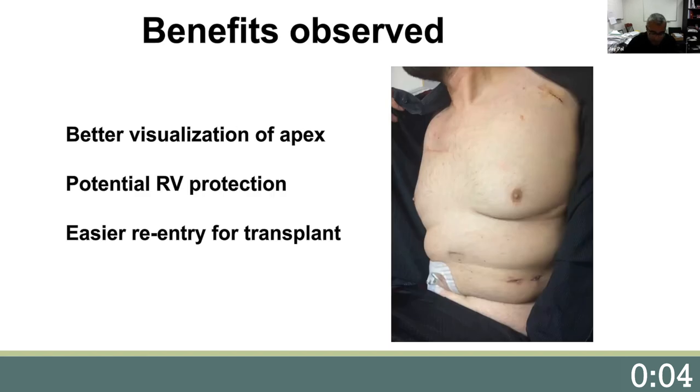There are numerous benefits to this procedure. The apical component of the implant procedure is simpler because the heart is not lifted out of the chest as it is for a sternotomy. This makes pump positioning more consistent and reliable.